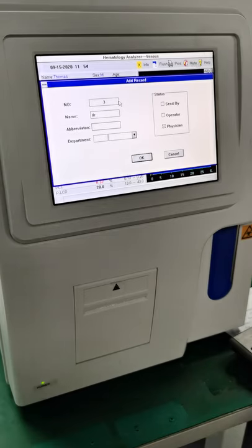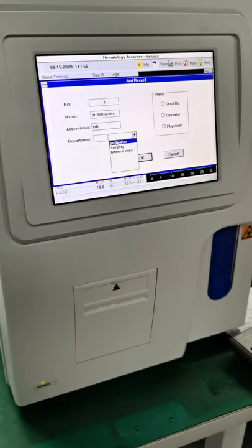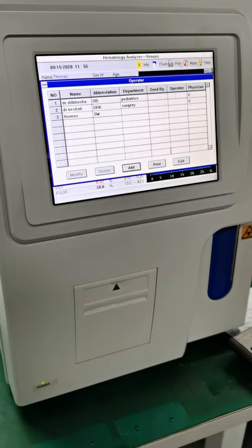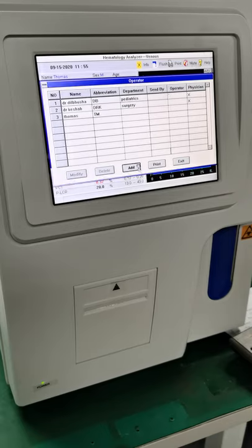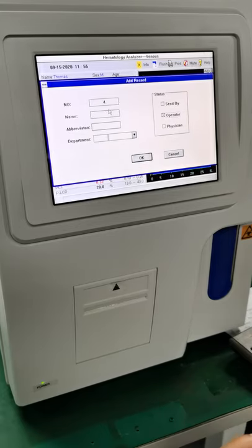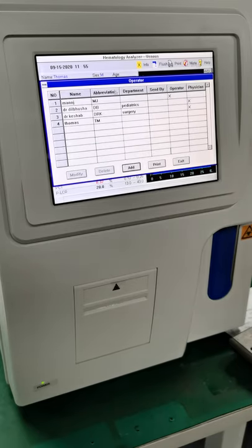For example, Dr. Deal Bhushan, abbreviation maybe DB, department, let's say pediatrics, just like that, okay? And if you want to add some more operator, you can click here and then add and the operator and maybe like Manoj and Jay, right?